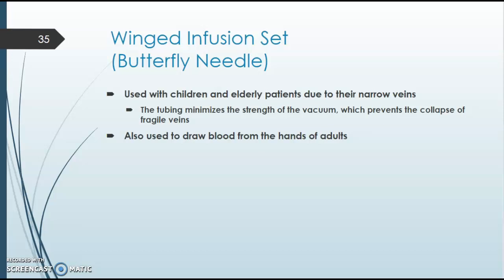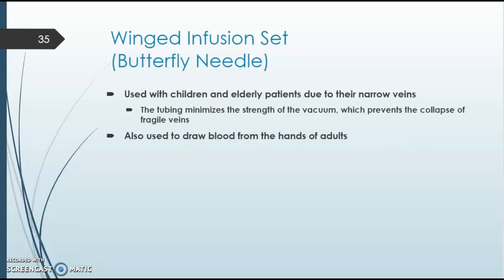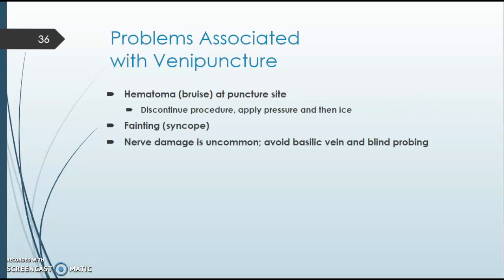However, it does take a little more time, and that's where understanding your patient and the situation is very important. You always use a butterfly needle in the hand. When you draw from the hand, it has to be a smaller needle, obviously, and you need to go in at a different angle, and therefore a butterfly would be used.